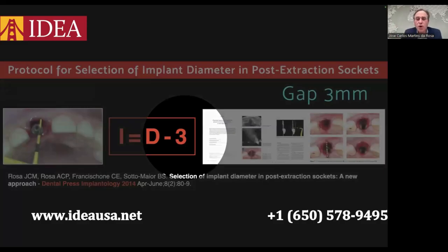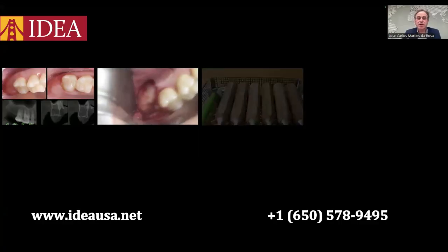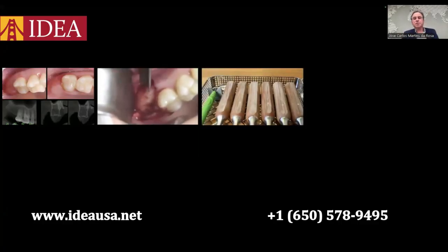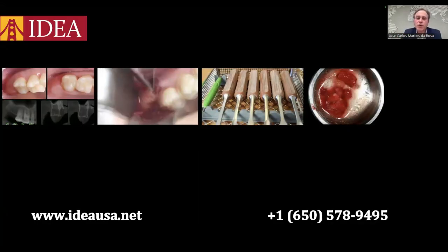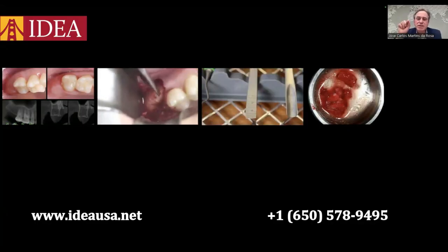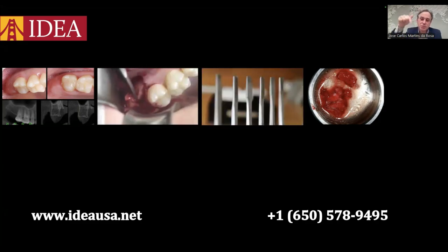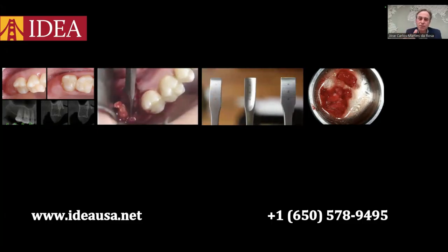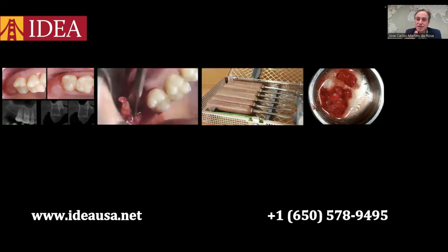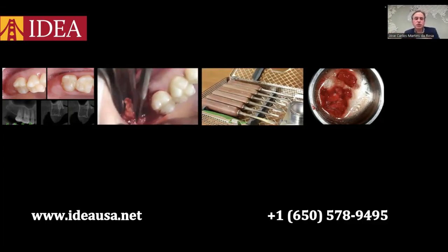So to harvest bone graft from the maxillary tuberosity, we previously need a clinical assessment, X-ray, and CBCT of this donor area. So we went to the donor side, raised the flap, and used chisels to harvest bone from the tuberosity area. The chisel has to be placed as perpendicular as possible to the bone structure. Right after, to go deeper inside the bone, we can control the length of the chisel inside the bone. After we reach the planned length, we fracture the bone.